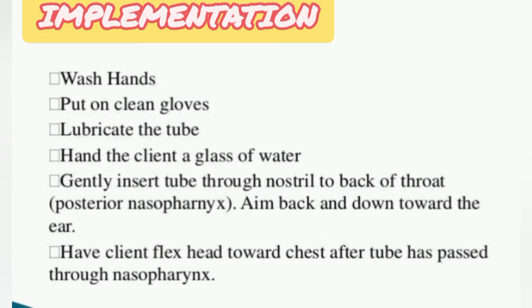Now coming to the implementation, we need to wash hands, put on the gloves, and lubricate the tube. Then we have to hand the client a glass of water.